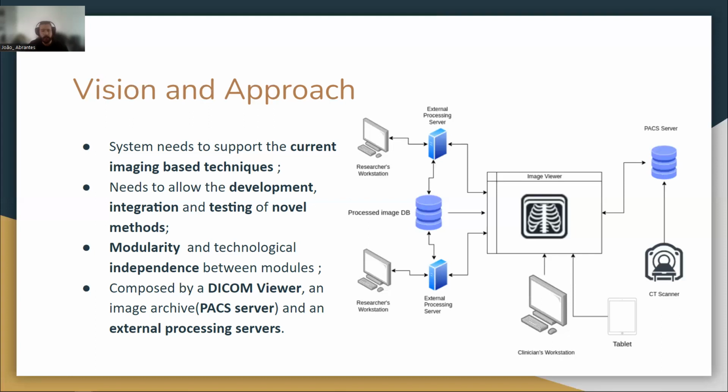It was decided to start with the image viewer since it will be the central component of the platform. And in this regard, we undertook some research on selecting the approach to consider for the image viewer.